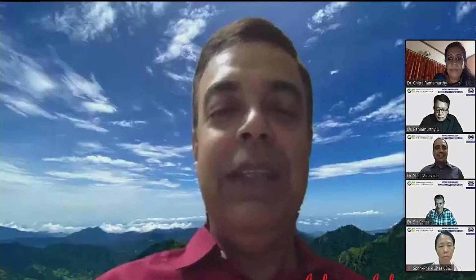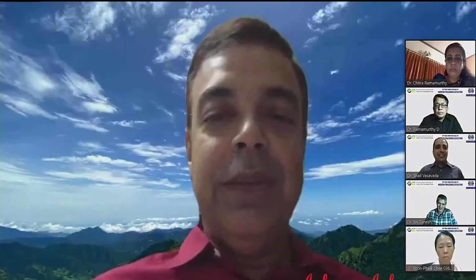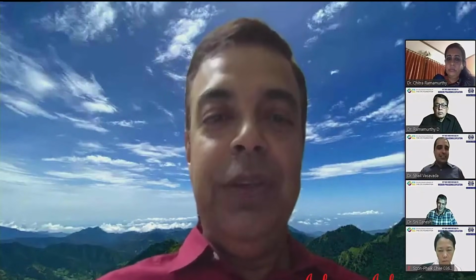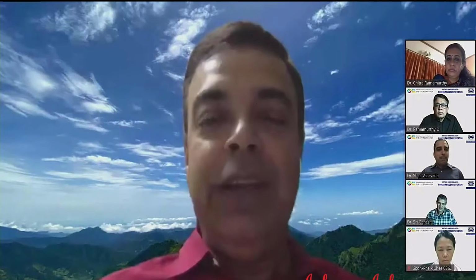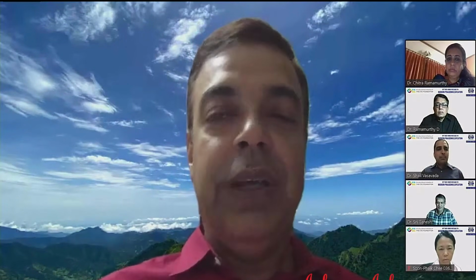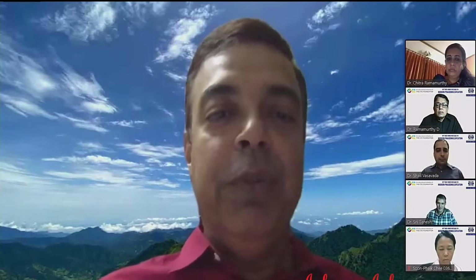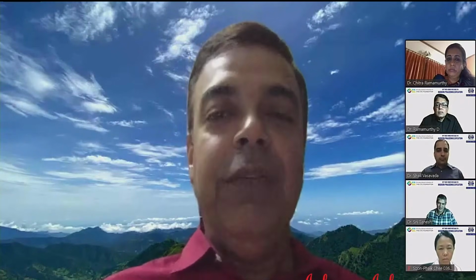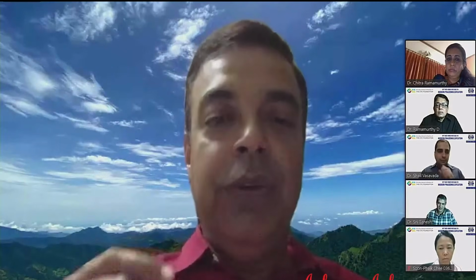Valid points, Gaurav. I wanted to add on the same lines. In fact, something else beyond what Shri said, that while Shail beautifully showed those videos, and his point is so well taken. The thing is that many anterior segment surgeons would hardly use the trocar once in a few months. So they're not going to be used to the amount of pressure to be used, and they're not conversant with using it every other day. So one has to be very cautious.